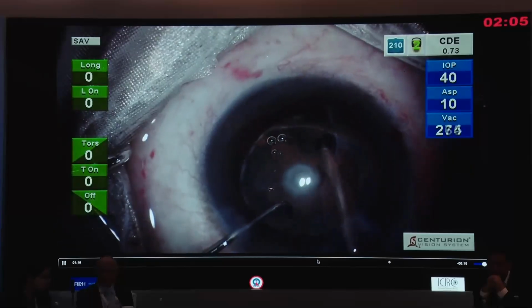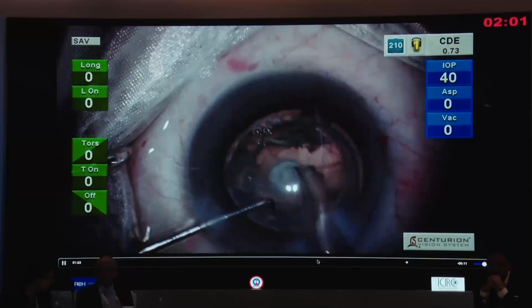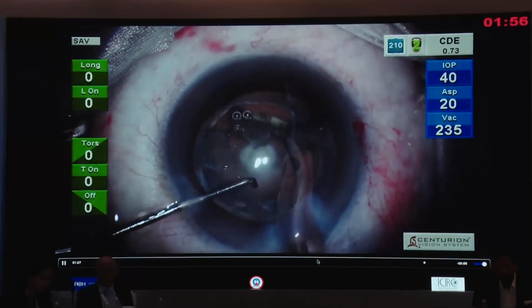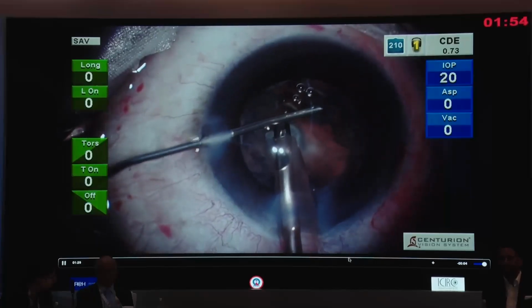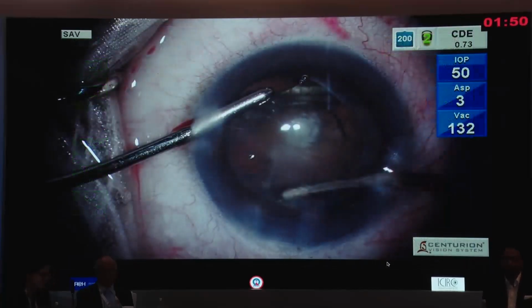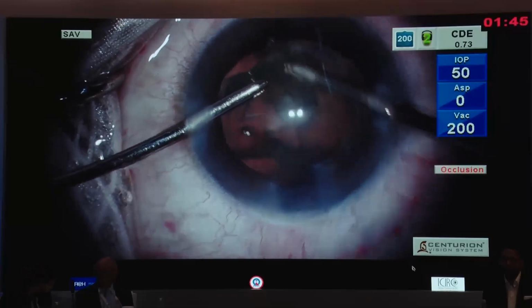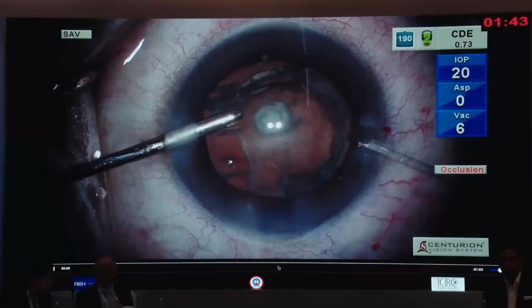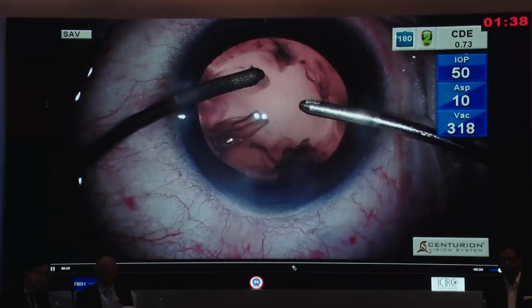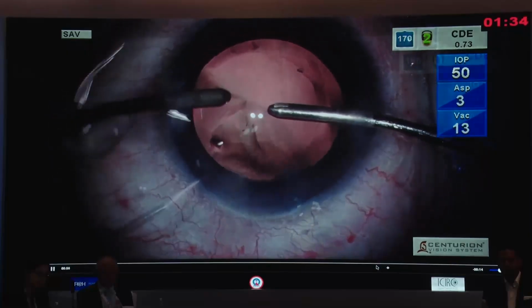You can do a subcapsular hydrodissection in the subincisional area also with the 90-degree bent cannula, or you can shell it out with the chopper as you did in the other part. So it doesn't matter what you do. But bimanual, if it is not a very thick epinucleus, also works very well, and you can clean that up to your satisfaction by swapping the instrument, and most of the time you are okay.